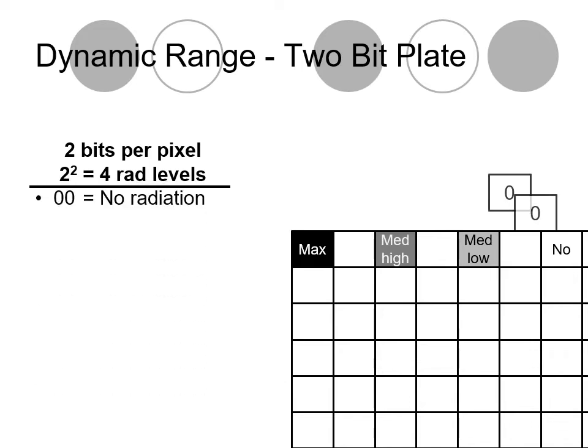The rightmost pixel is screened by thick bone and no radiation reaches the pixel. Therefore, 2 memory locations both record 0. When translated by the computer, this pixel is assigned a color value of white. The next pixel to the left is covered by thin bone and therefore receives a low amount of radiation, so the pixel records a 0 and a 1, which is translated to a digital 1. When the computer maps a density value to this pixel, it assigns a light gray color to the pixel.